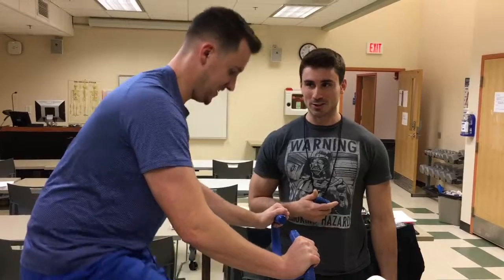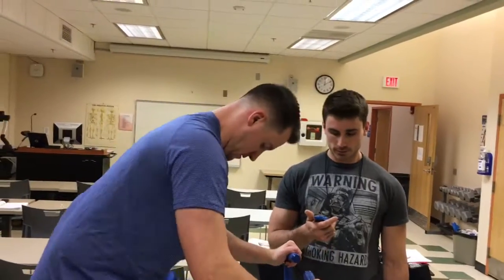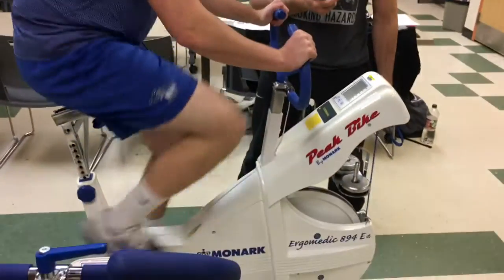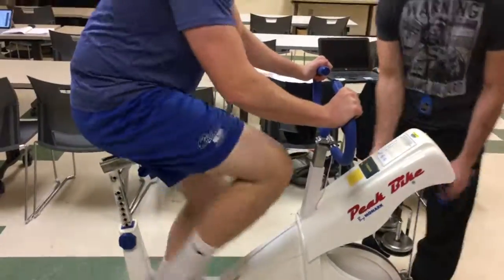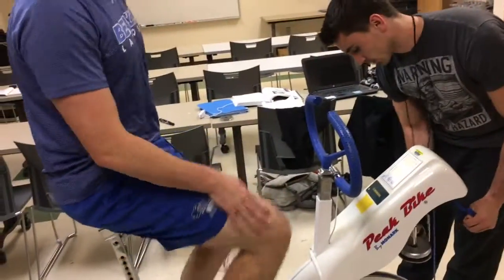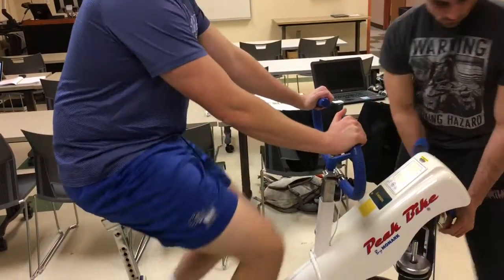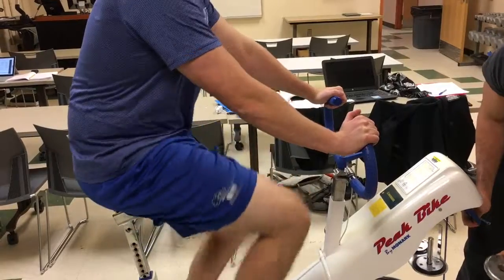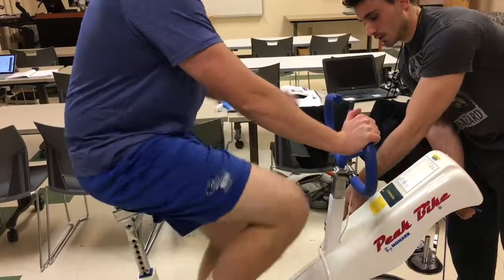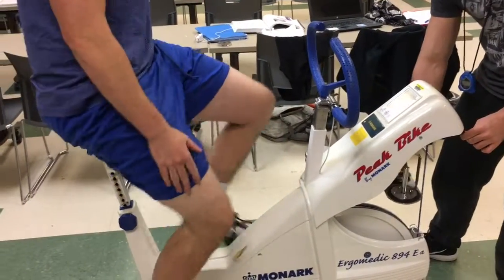How about we just get you right into that exercise? Let's go for a sprint in three, two, one — three, two, one — and then I'm going to take the load off and let you just do some light pedaling. Jeff, do you want to keep going for your cool down or would you like to just stop completely? I can stop completely. Great. Thank you. And that's the warmup protocol for the Wingate test.